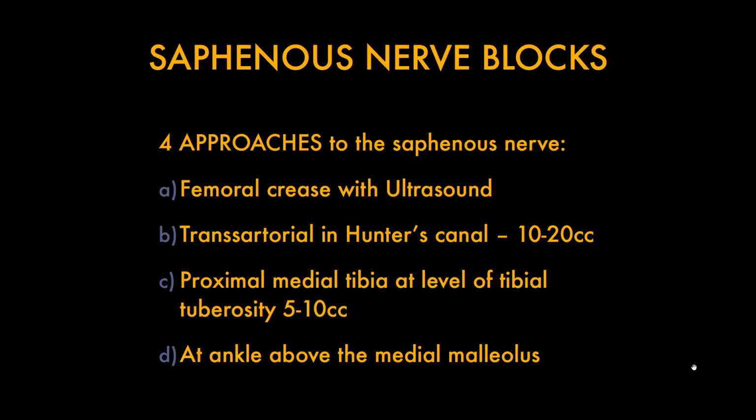So you're going to use this saphenous block, this adductor canal block, for the knee, but you can also use it when you have a bimalleolar fracture and you want to get the medial malleolar coverage, or a BKA. So it's not the other half, but it's another piece of the lower extremity.